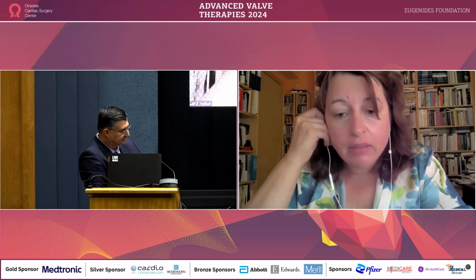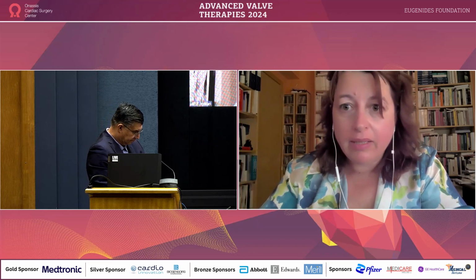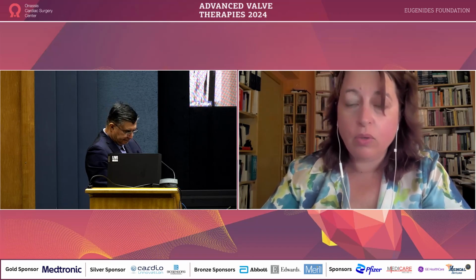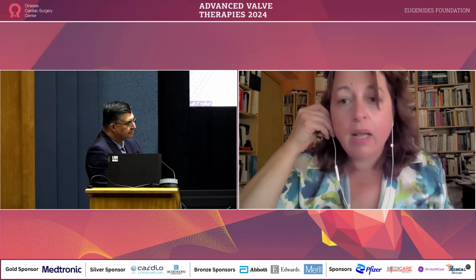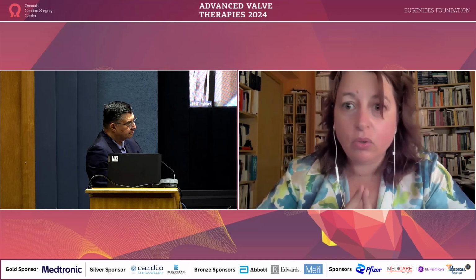Because I find it difficult that a tomographic modality like CT or even MRI cannot accurately give the angulation and the course of the leak. It depends on the reconstruction you want, and probably this is a communication failure between us and you. And as it applies for everything in life, the best modality is the modality that is more accessible to you and you have been more familiarized to.